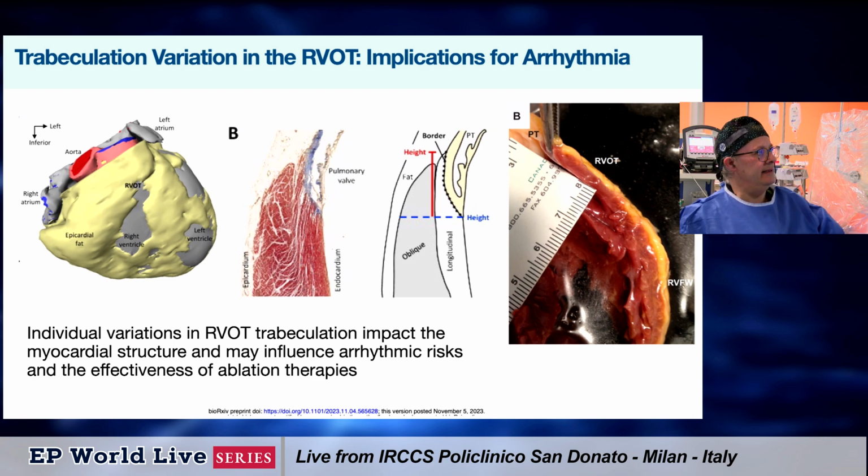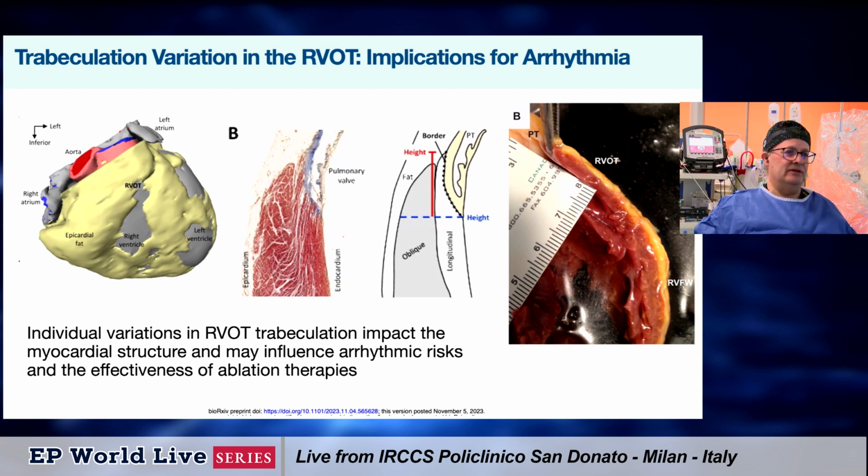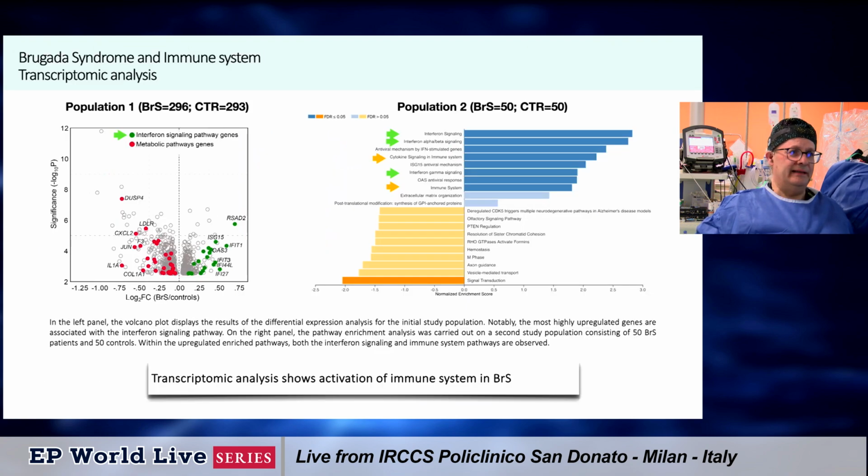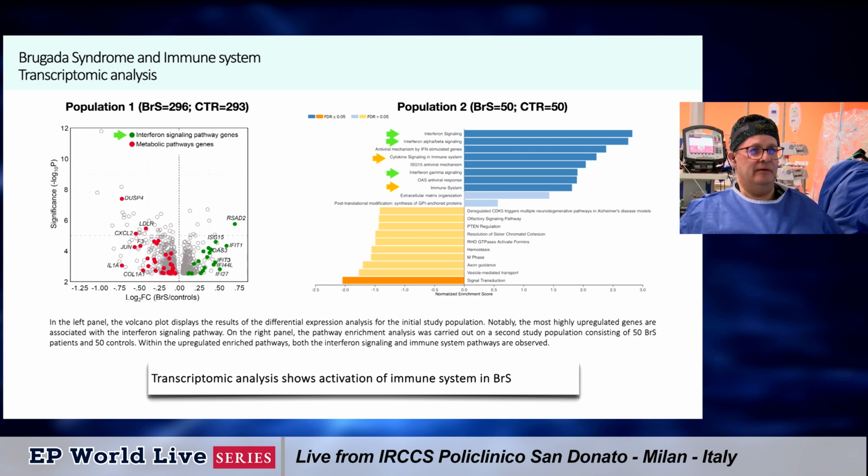We also did in this patient the CT scan reconstruction with the visualization of the normal muscle on the anterior wall of the right ventricle, the localization of the fat, and very important in the young patient, the identification of the anatomical localization of the coronary artery. So in every patient, we do the CT scan to exclude the presence of the coronary artery in the region of interest.